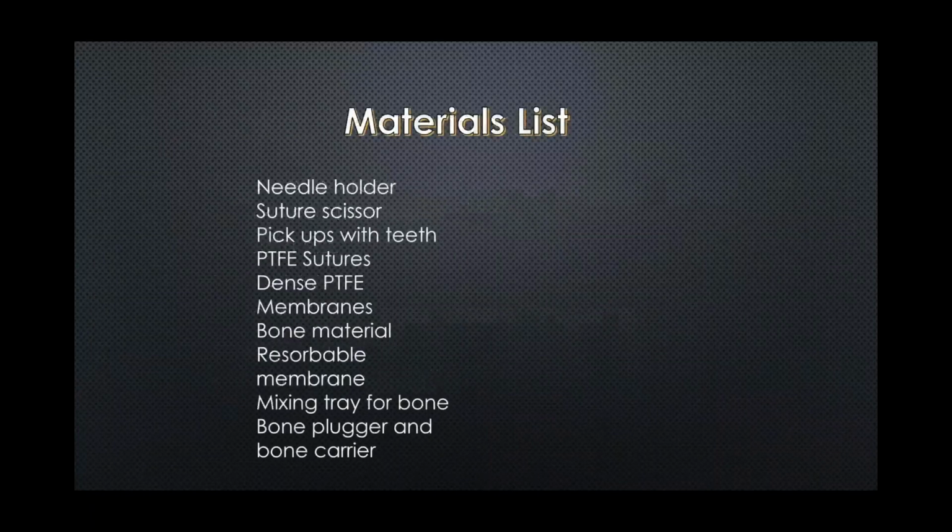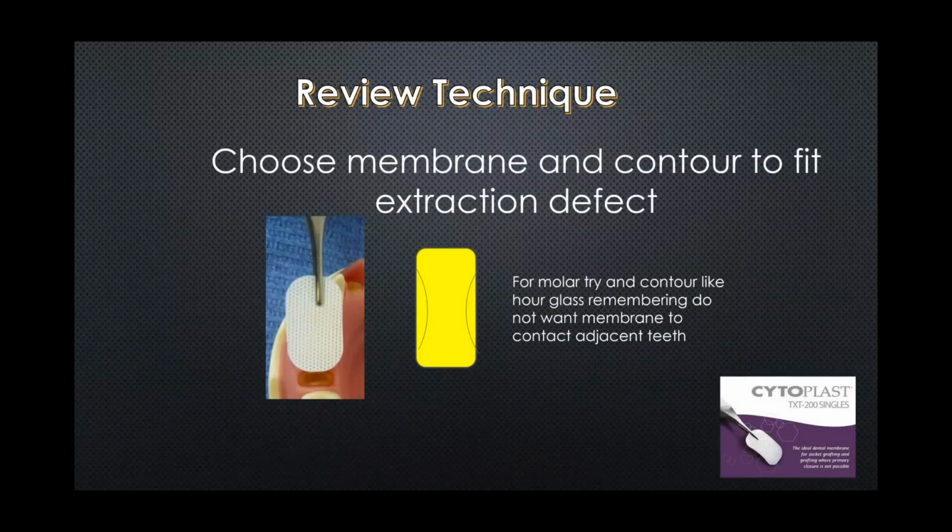Okay, and this is our materials list. We always recommend, once again, that we set up a needle holder, suture scissors, and pickups with teeth. We like the PTFE sutures, dense PTFE membranes, your bone material, pluggers, bone pluggers, and bone carriers. And last few slides, and then we'll get to some questions.